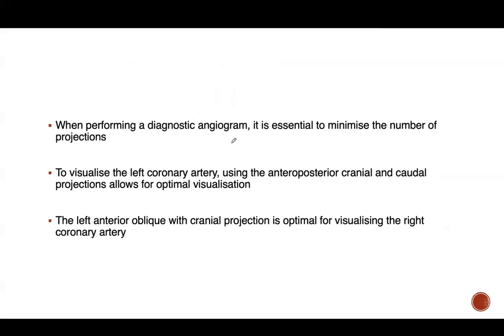When performing a diagnostic angiogram, try to minimize the number of projections as well. For example, if you want to visualize the left coronary artery, anteroposterior cranial and caudal projections are sufficient for optimal visualization. And if you want to visualize the right coronary artery, a left anterior oblique with cranial projection is sufficient.